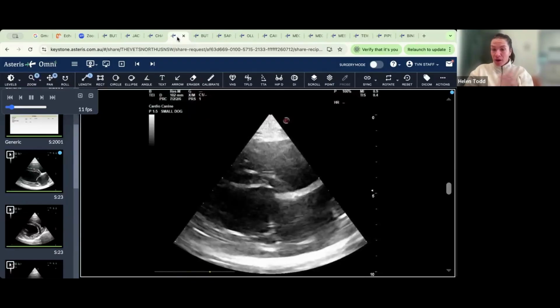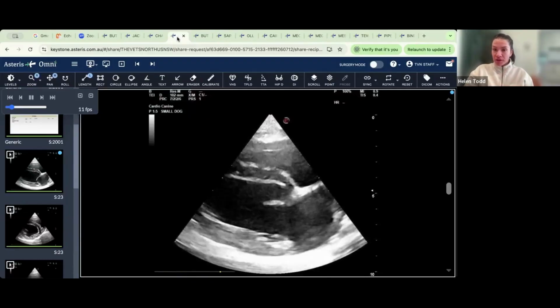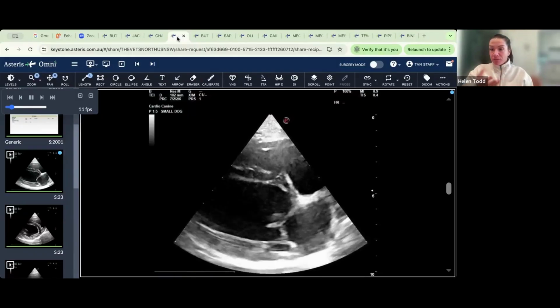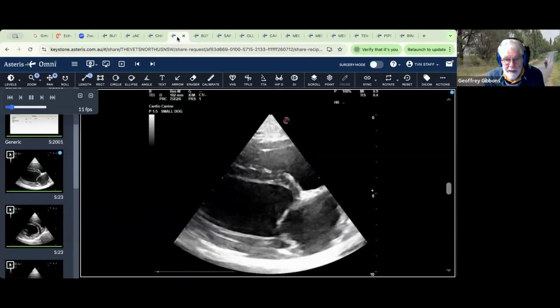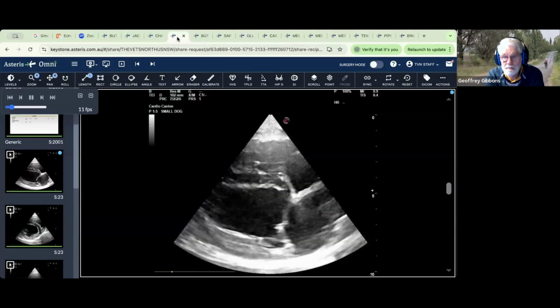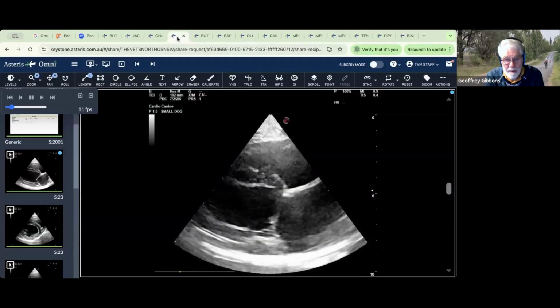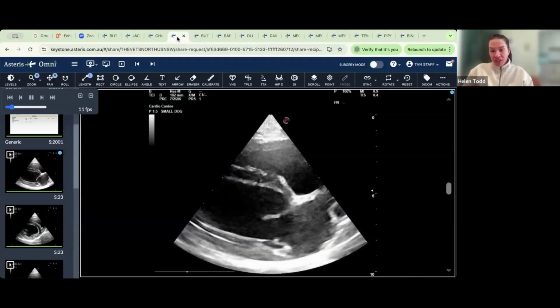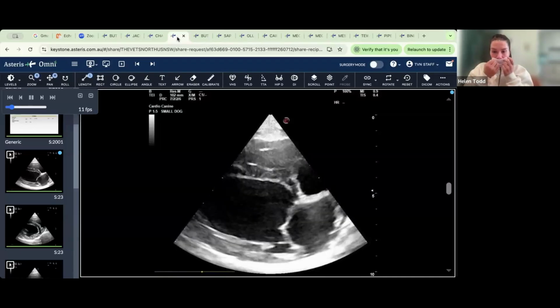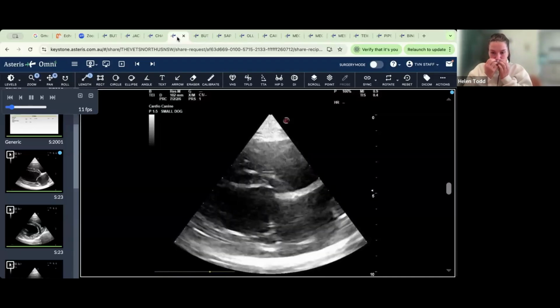So this is a dog with mild DCM with a reduced fractional shortening. There's some very echo dense material in the left atrium. Yeah, do you know what's really annoying? You're so right, Jeff. That's actually completely an artifact, even though it absolutely looks like smoke, doesn't it?